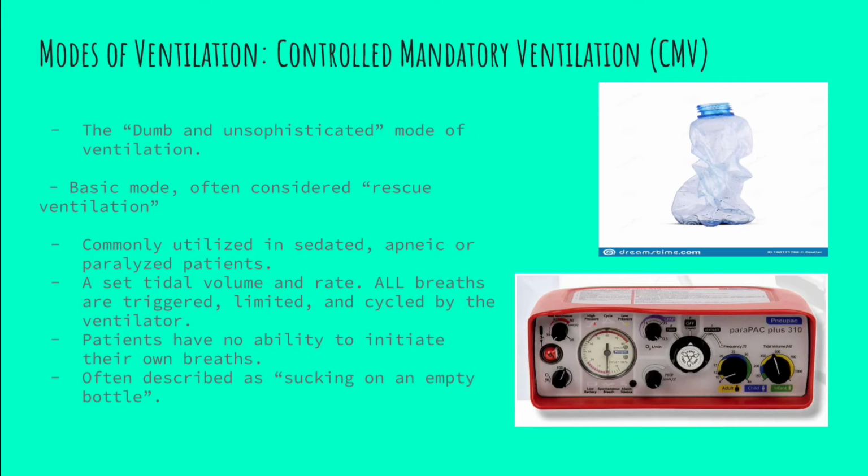So now let's get into the modes of ventilation. Controlled mandatory ventilation is a mode of ventilation that's been around for quite a while. It's pretty common still to see this on certain ventilators. A lot of the pre-hospital ventilators that we see that 911 trucks are carrying truly are controlled mandatory ventilation ventilators. This mode of ventilation is often referred to as more of a dumb or unsophisticated version of ventilation, and that's not a shot at the people using it. It's more or less describing the mode itself.